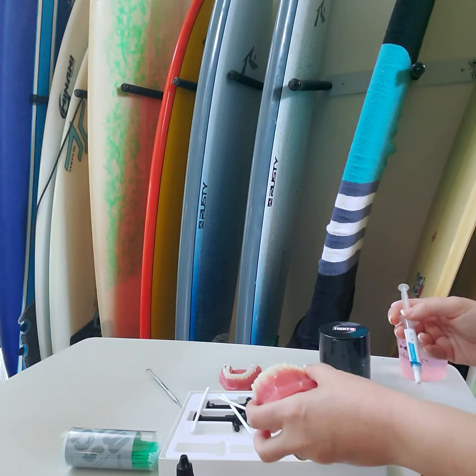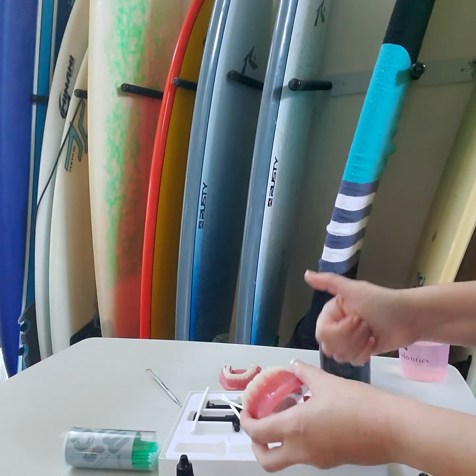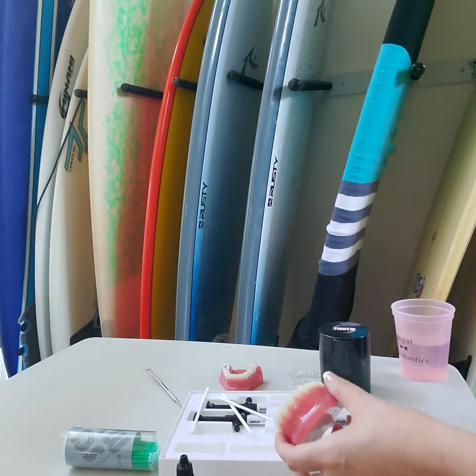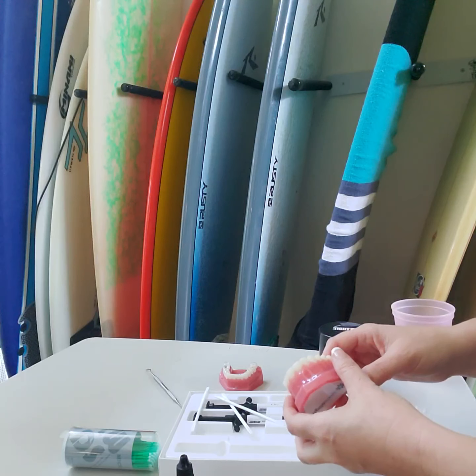So it's good to have the file open when you do it. Put the little dab on, okay? Let it sit on 15, 20 seconds. Water rinse, air dry, and then count again. Count all your spots. Your 12 spots or your 11 spots should be chalky dots. So count them, you know, 1, 2, 3, 4, 5. Okay, great. I got all those.